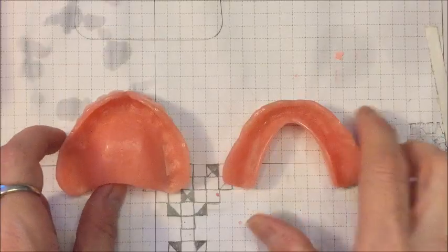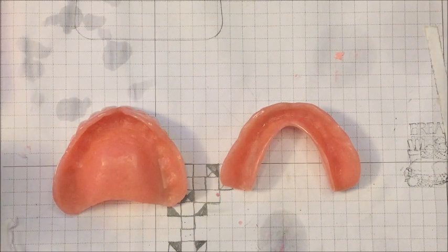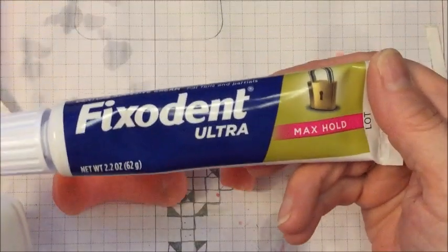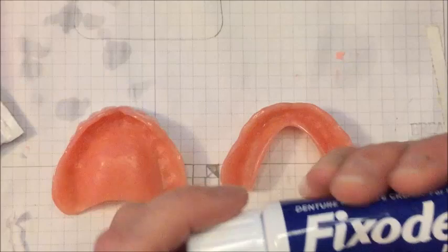I'm going to aim the camera down, put on my glasses, and show you what products I use and how I glue in my teeth. Here I have my dentures — I'm at my crafting desk. For the bottom and top dentures I use different adhesives, and this just comes from experience learning what works best for me. For the bottom denture, I use Fixodent Ultra Max Hold and Fixodent Extra Hold Powder.